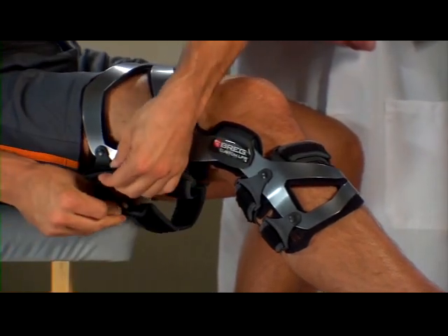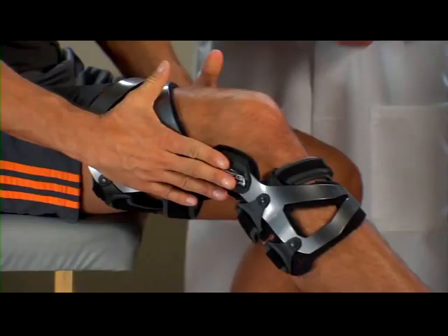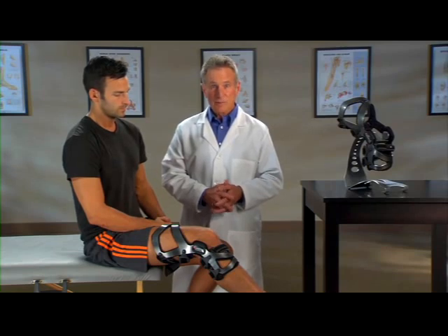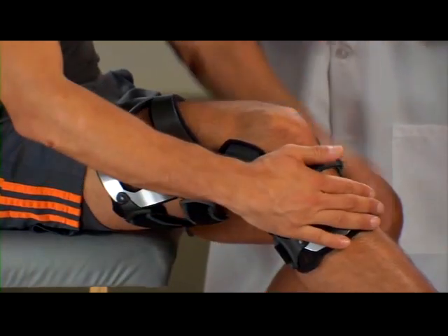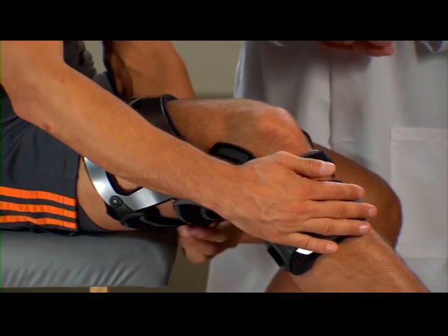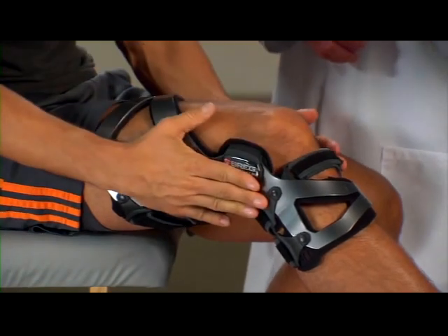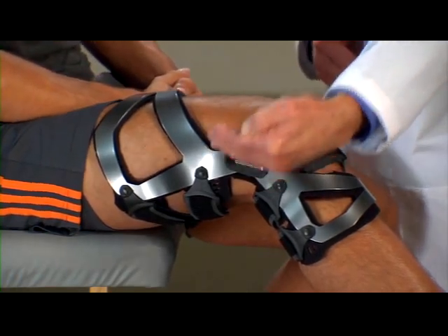After you've been active for a while — about five minutes or so — your body fluid levels will change, making your brace feel loose. You'll need to re-tighten the brace straps. To re-tighten, sit with your knee bent at a 30-degree angle like before. Press the thigh and shin cuffs flat against the front of your thigh and shin. Loosen and then re-tighten each strap one at a time in the proper order. Remember to apply equal tension to the straps, and be sure the brace hinges align with the top of your kneecap and that the hinges are at or slightly behind the midline of your knee.